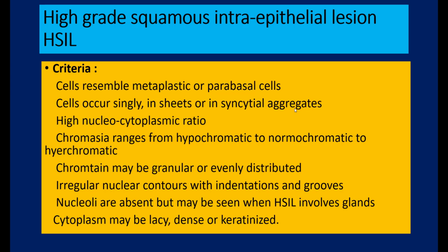Next, we move on to high-grade squamous intraepithelial lesions, HSILs, right? Now, these lesions can come in a variety of flavors. There is a wide array of morphologies, and we are going to see them one after the other, as a result of which it can lead to a considerable amount of diagnostic difficulties. But just to summarize what we are going to see in the next sequence of slides, let us summarize the findings on a single slide.